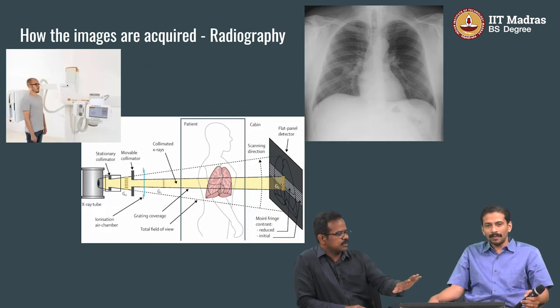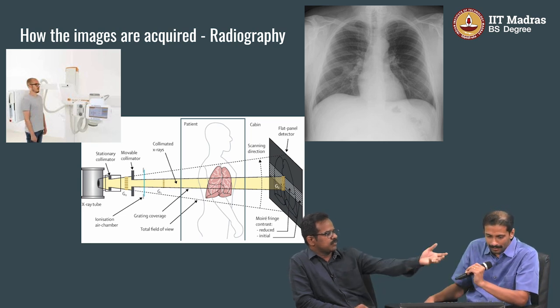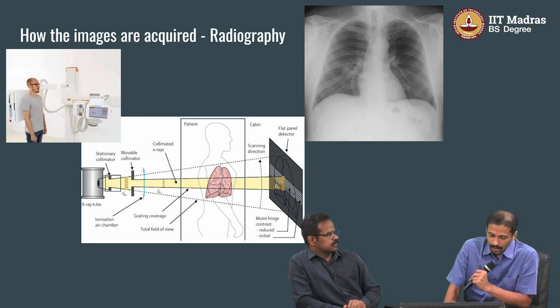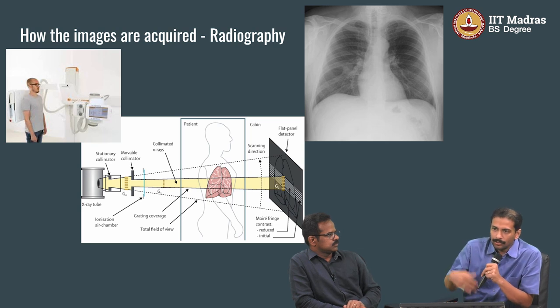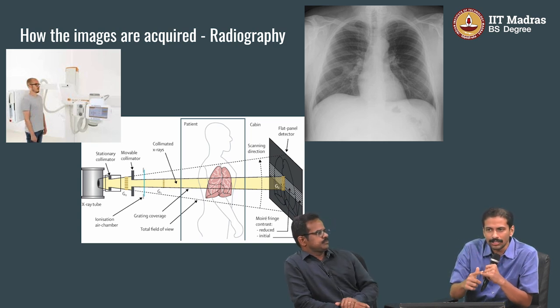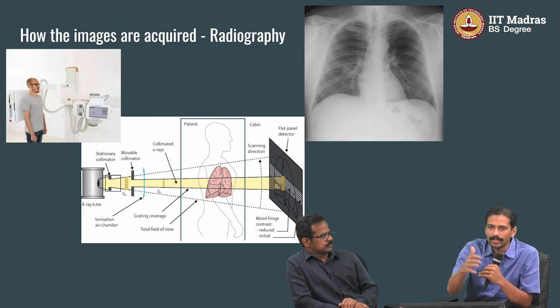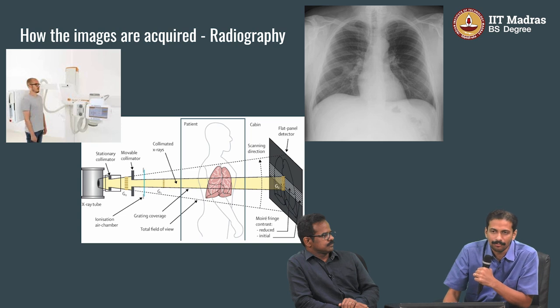So, Deva, what are the variables which may affect this image, starting from the source? Yeah. Like I told you, in any photograph there are parameters. Most of the time you just click the button, that's all. But behind this there are a lot of parameters: aperture, exposure, shutter speed, ISO, focal length. You choose multiple things, but most of them are done by a preset which does it for you.